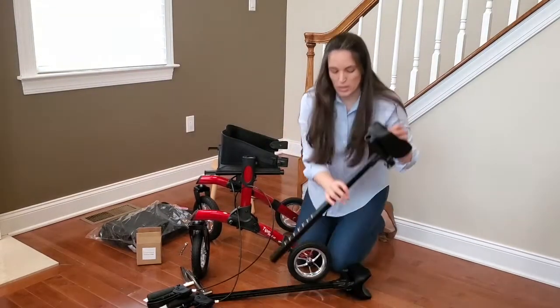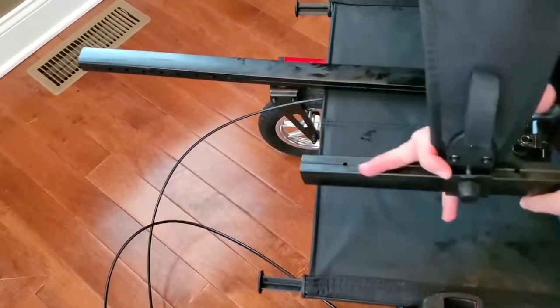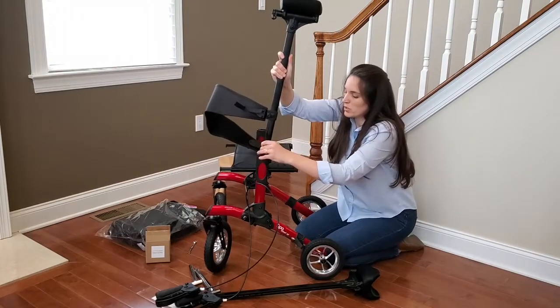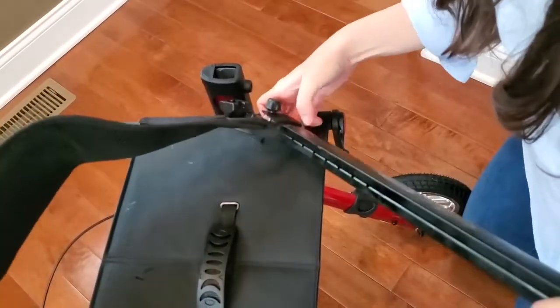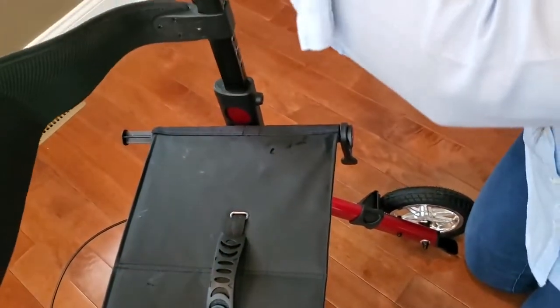Now insert the handle — remember, the numbers have to be on the inside facing you. Later you're going to use this to adjust the height of your backrest, but for now we're just going to leave it until we do both sides. Here's the other side — same thing: unscrew, insert the armrest into the backrest, and put it into the structure.